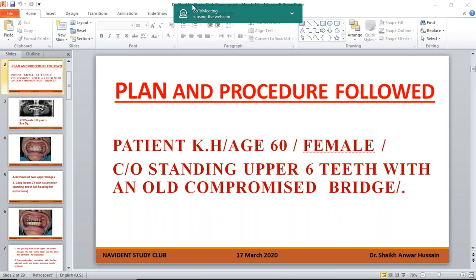Sorry, Luca. Keep going. That's okay. I was just going to say, the ring fiducials were trialed just as a prototype, but they're not actually going to be carried on, I believe. It's all about, in the first instance, finding an accurate way to register. You need to be able to register where you don't have sufficient tracing points or teeth. I have actually successfully registered by tracing a ridge as well, but you have to be quite accurate about which area you're tracing when you do that, and not all ridges are very easy to run the tracer tool over. But the new protocol, yes, it ticks all the boxes.